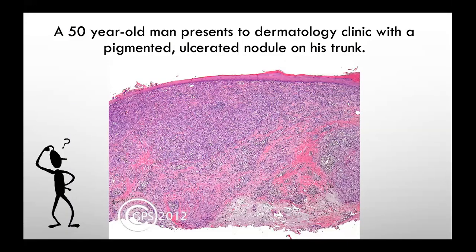So how to approach the diagnosis? When you see a slide, there are lots of details, and it can be a difficult process to know what's important and what's not, where to begin, where to start. So first of all, don't panic. Take a deep breath and think in a systematic way, especially for residents R1 and R2. Take your time and look at the slide. Usually I have a systematic way of approaching the slide. First of all, I ask myself, is it a neoplastic or an inflammatory process under the low power? And sometimes it doesn't fit either of them.